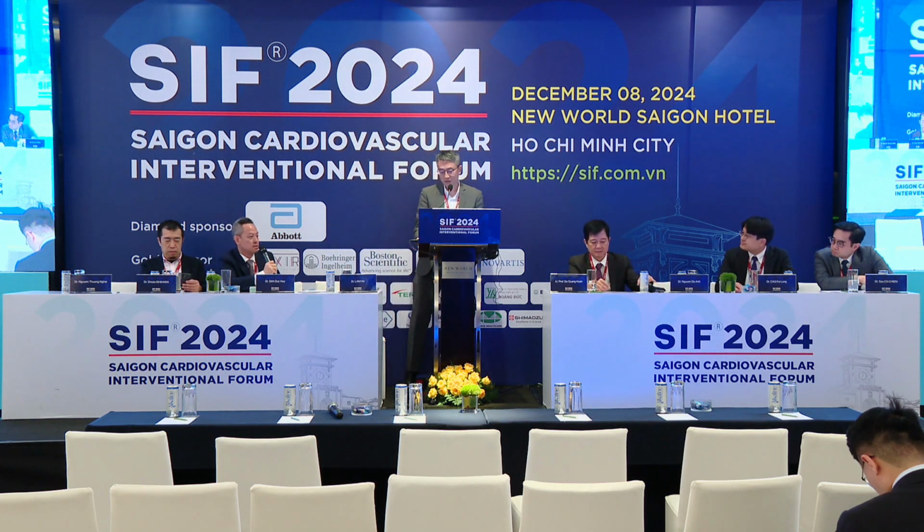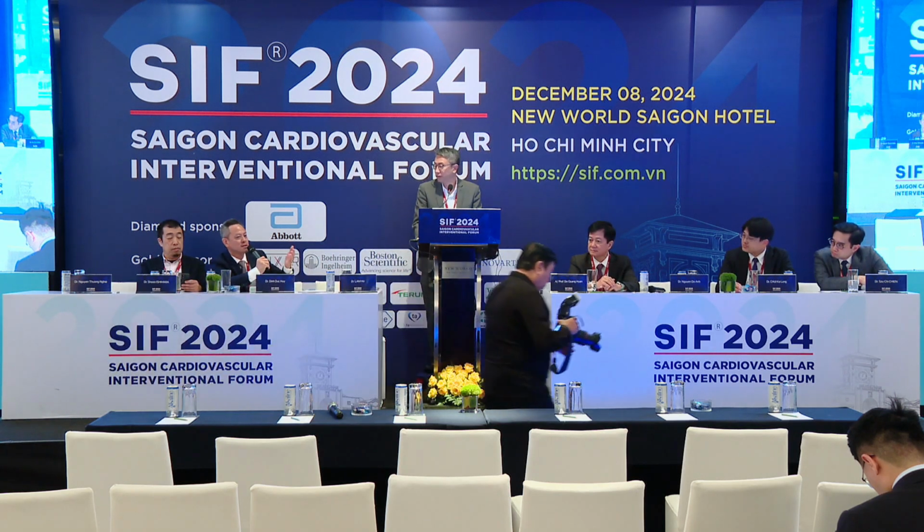I have a comment. So I totally agree that in this kind of situation, I think mostly 100% of surgeons will refuse the case from the very beginning. Or they just tell us, you stabilize first, and then I will do surgery. But how to stabilize? Really no. And then I have a few cases like this one. We try to save the patients by IABP because Impella is not available in Vietnam. And yes, we do PCI, but I see most of the cases die a few days later because of multi-organ failure.